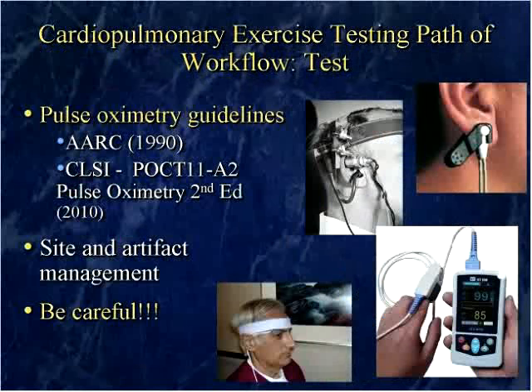If you have someone that has normal pulmonary function, normal DLCO, and they're starting to desaturate, take that site and either move the probe to another site or take it off the finger and rub it vigorously and place it back on. Even if your signal indicators are indicating that it's doing well, just move on from there because it'll make a huge difference.